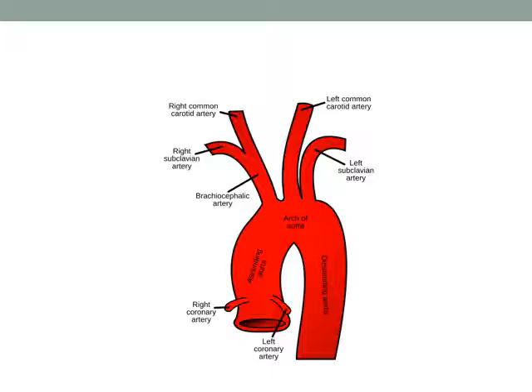There's an interesting comment just made, which could be the right answer under some emergency situation. We could increase the flow and say, well, as bad as it was before with the heart not being able to recover, it's even worse now with hypoxia in the brain. Let's just increase the flow and send red blood throughout the entire aorta and stop the aortic valve opening. That actually could be an emergency situation you could do, where things are really, wheels are coming off, you've got to do something. But it's not a good long-term solution and has serious drawbacks. It's not a bad thing to think about, though, and it could be the right answer under some circumstances.